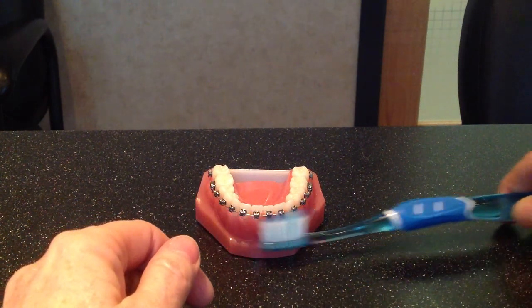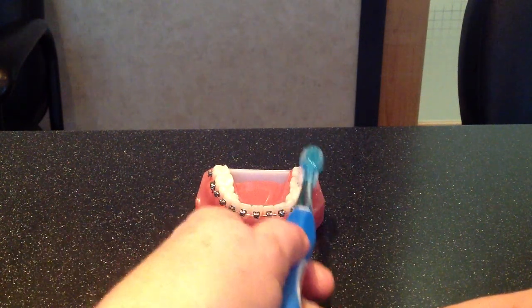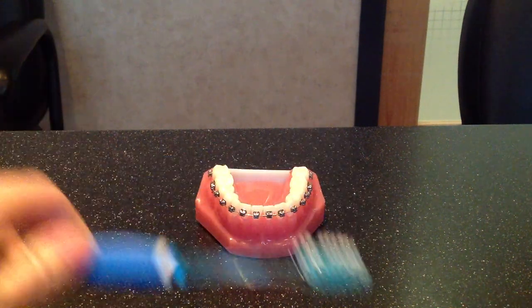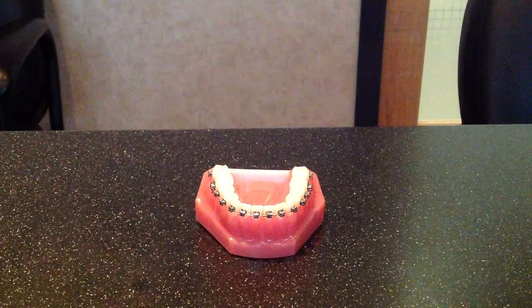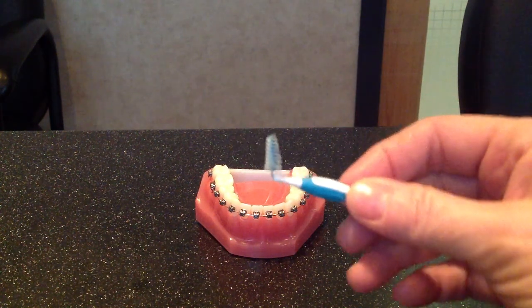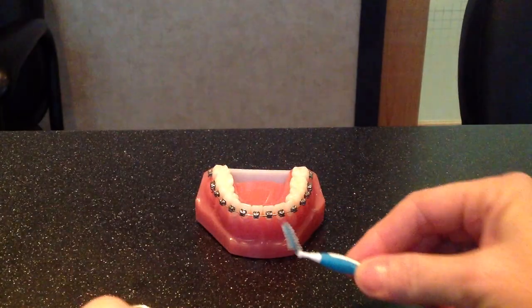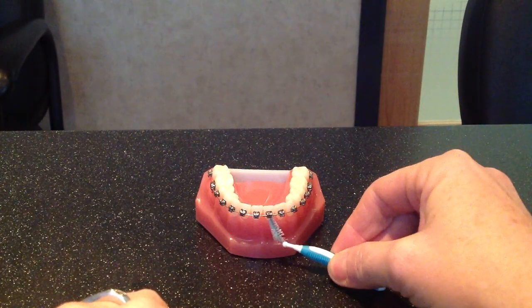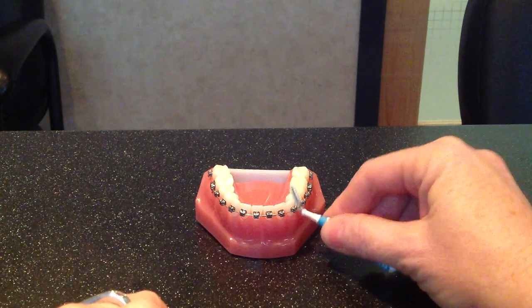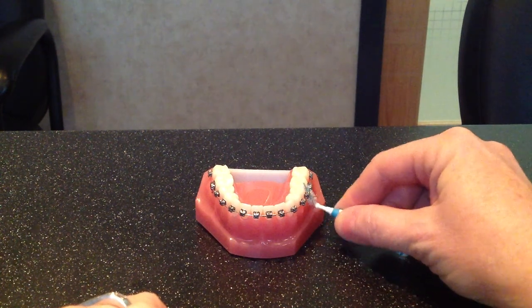That's good enough for after a snack, but at least twice a day — preferably three times a day — you want to do a really thorough job. Take the bulk of the food off with your big brush, but then go around with this little itty-bitty brush. This is called a proxy brush, and it has a little bendable head so you can bend it for comfort. Use it right up under the wires in between the braces to make sure there's nothing stuck that your big bristles can't reach.